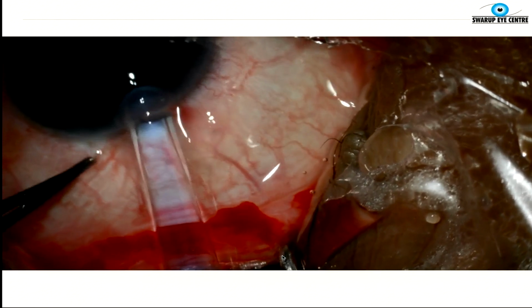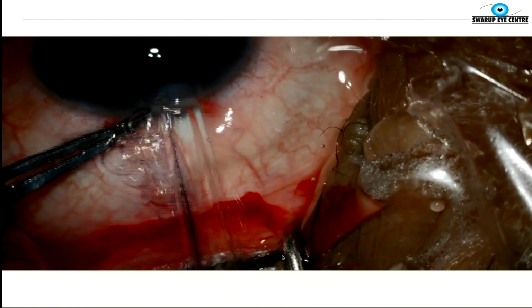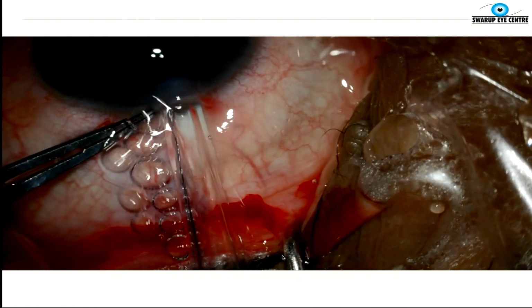You have to gently inject your graft in. It's important at this point, when your graft has gone in, that you make sure that the eye is soft. Otherwise, when you come out, the graft tends to come out. Also, you have to give some counter pressure to hold the wound as you're removing your DMEK injector. Otherwise, again, the graft can slip out.